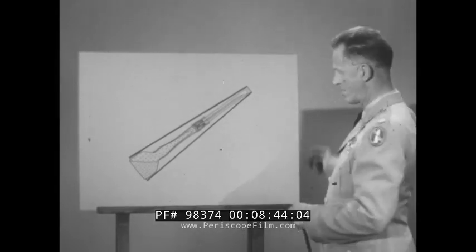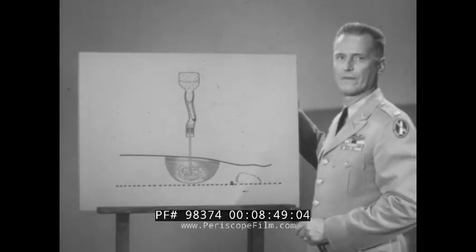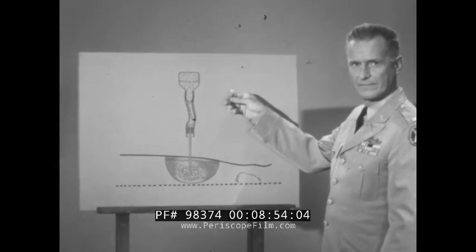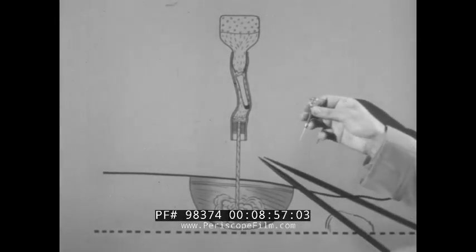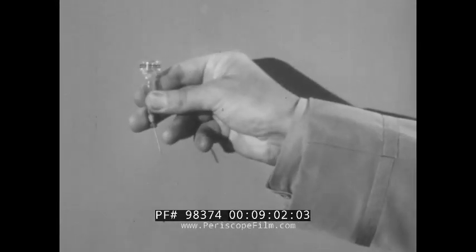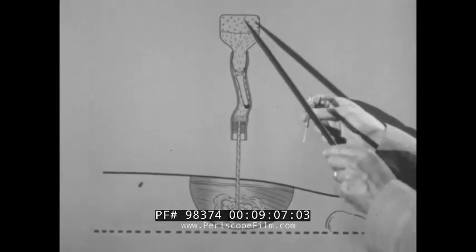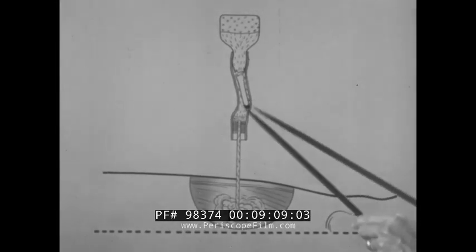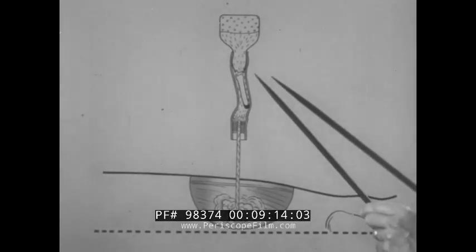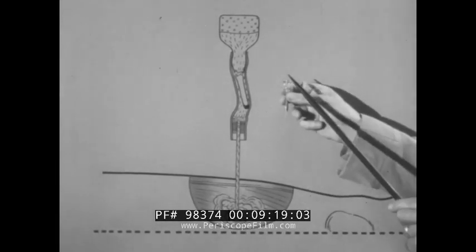Here's how the ampin works. Turn the bottle bottoms up like this. Now insert the needle into a muscle and break the neck of the bottle. Gas pressure in the bottle automatically forces the atropine into the muscle when the neck of the bottle is broken. But remember, the gas can only force the atropine solution out when the bottle is bottoms up.